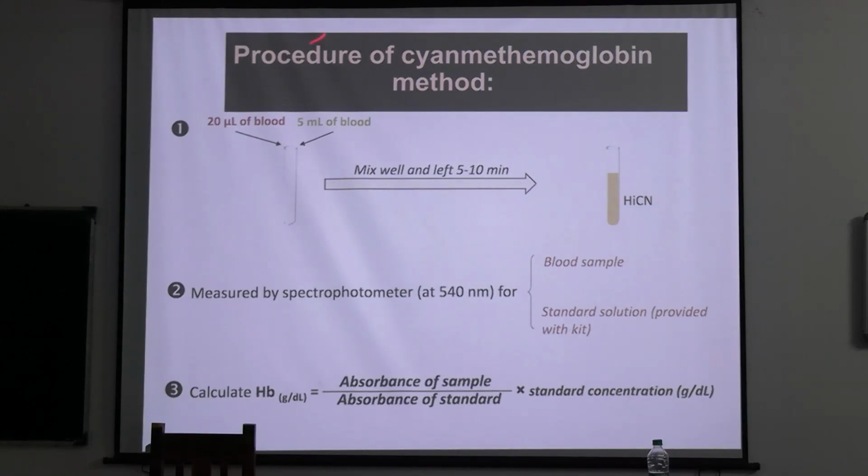This thing will be asked in the examination. You have to show this Sahli's hemoglobinometer, this acid hematin method, and this is the method that you will be asked about. How do you do a cyanmethemoglobin method, and how do you calculate the hemoglobin from the cyanmethemoglobin method? Here you get a calculated value, there you are getting a compared value, you are just comparing with your eyes. Here you have to calculate the value of the hemoglobin. So when you do a calculation, it is always better.